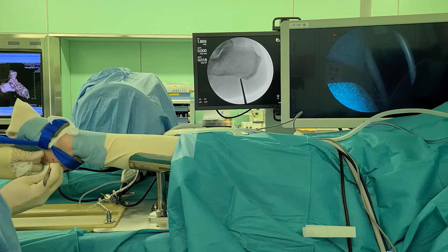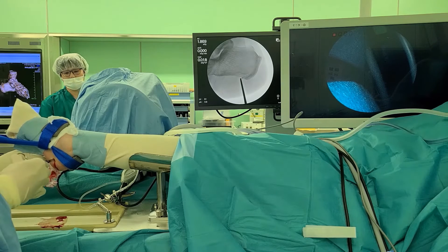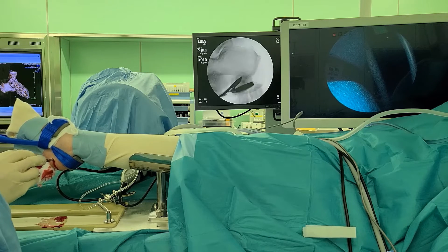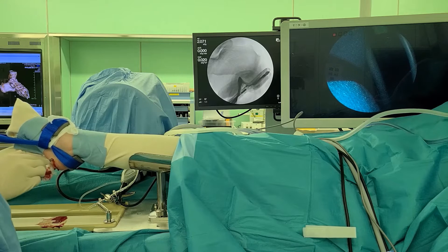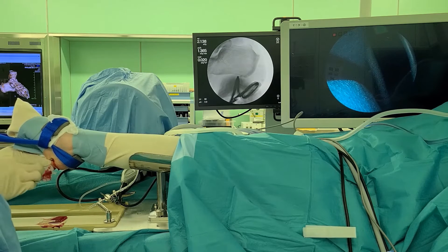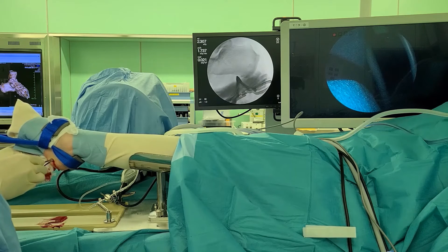5 mm skin incisions were made on the planned medial and lateral portals. A straight mosquito forceps was introduced to the skin incision. The medial edge of the plantar fascia was palpated using the tip of the mosquito forceps, and the forceps was advanced on the plantar fascia to reach the calcaneal spur, where blunt dissection was performed.